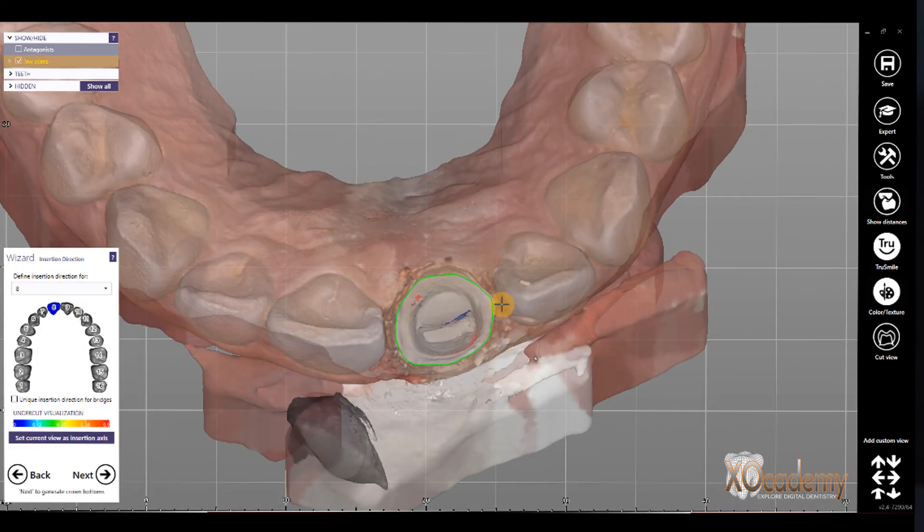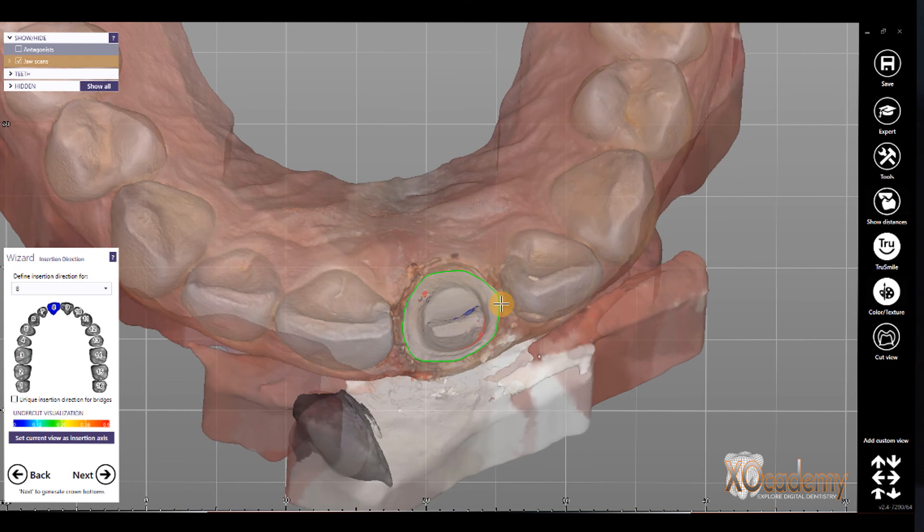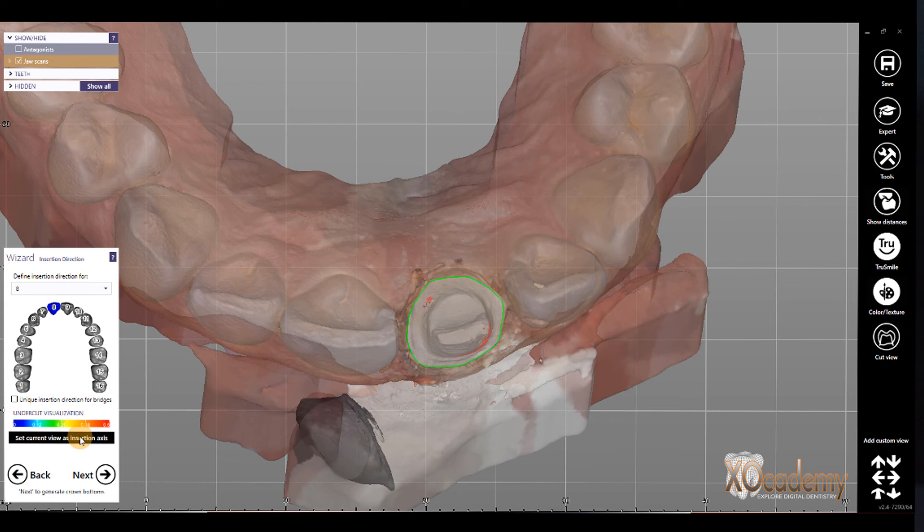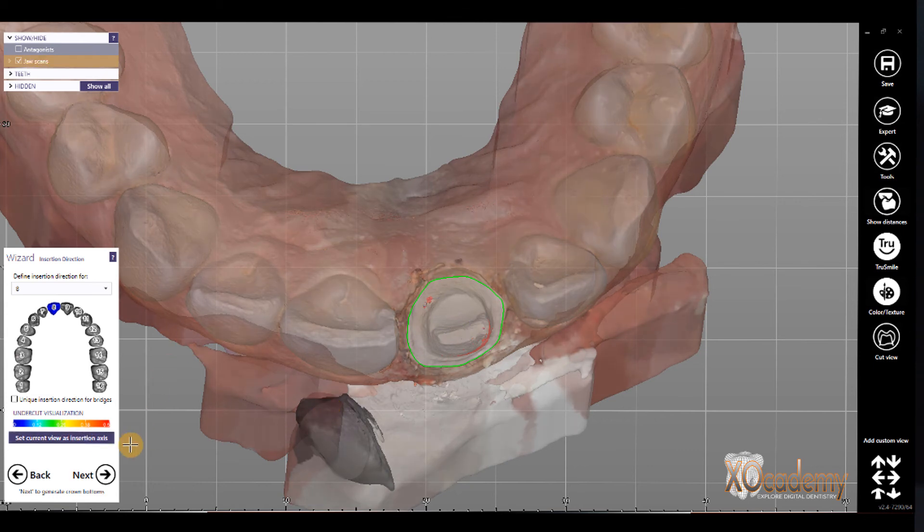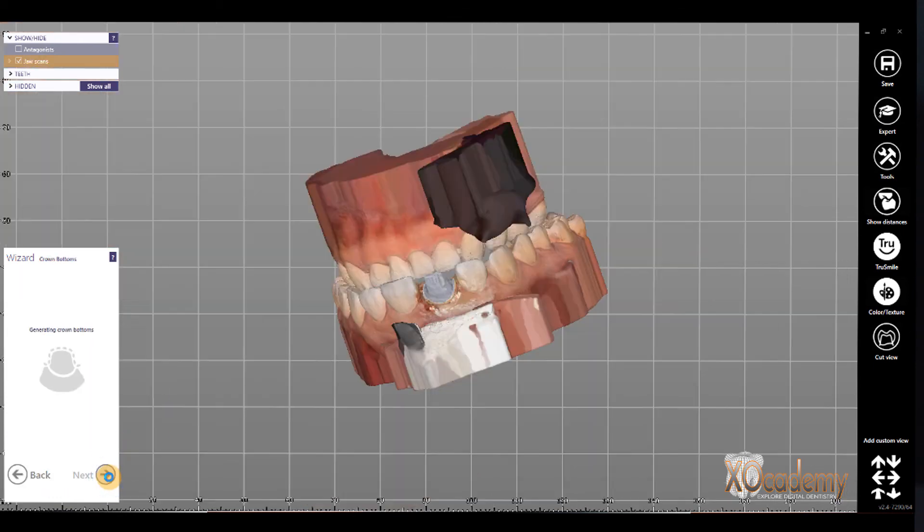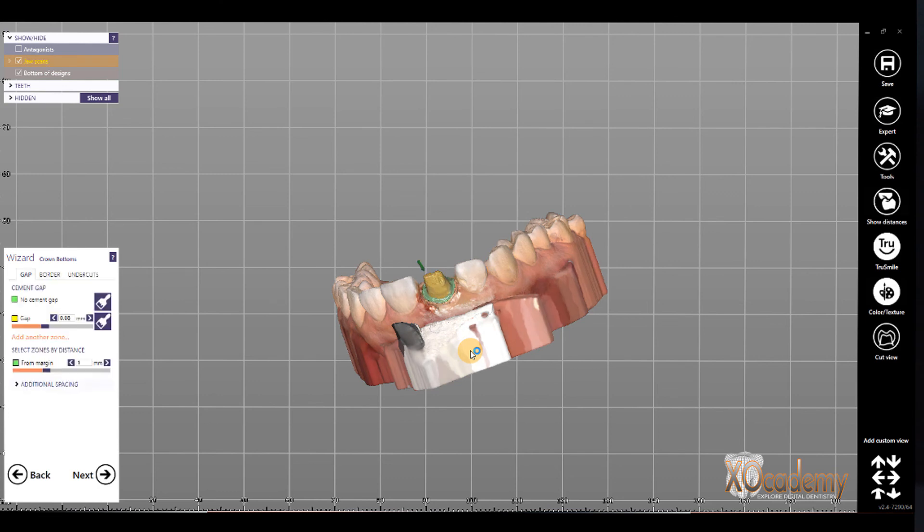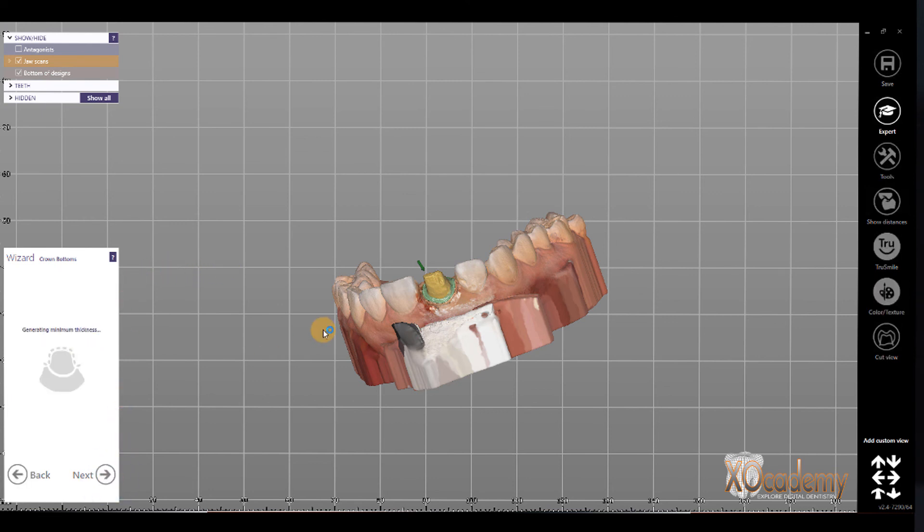And now we're brought to the end. To insertion direction. So, this is great. Our XML tag for insertion direction stuck. It's saved. And so, we're going to do that for our, all of our crowns now. We're going to define the insertion direction before moving forward, with the crown bottom step. This is also helpful when designing bridges, because then we can define a uniform insertion direction for bridges.